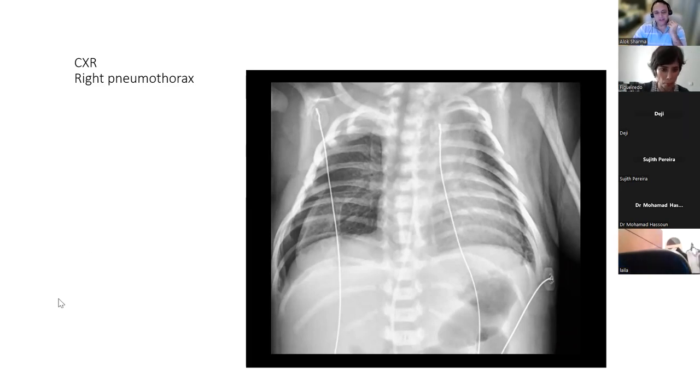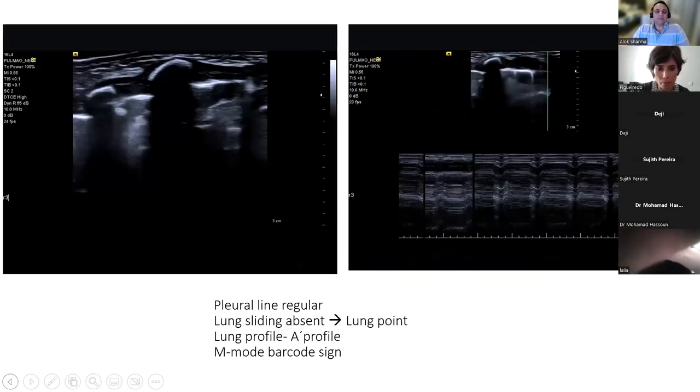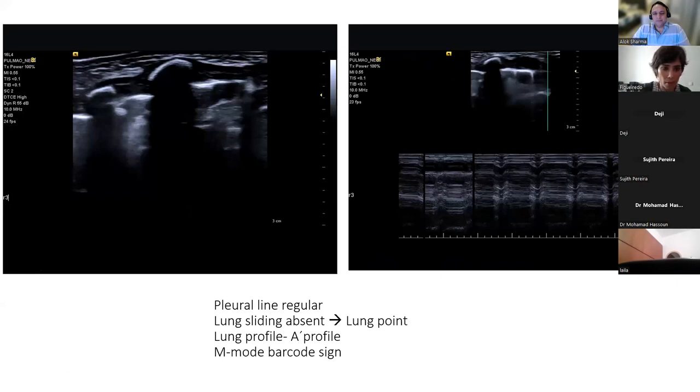Okay, so now the bets started. So we're putting odds on this. So Doris says RDS, Anna says bad TTN. Okay, Sharif kind of feels this is more RDS because of the consolidations. Anybody else, guys? Come on. Sujit is RDS. Margarita's TTN. Yeah, Mayank feels it's MAS, but no history.